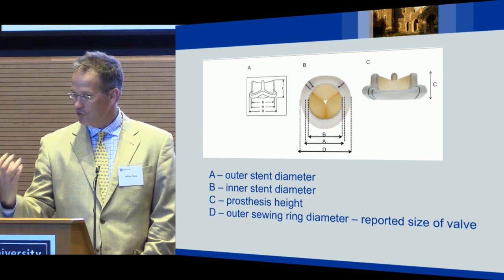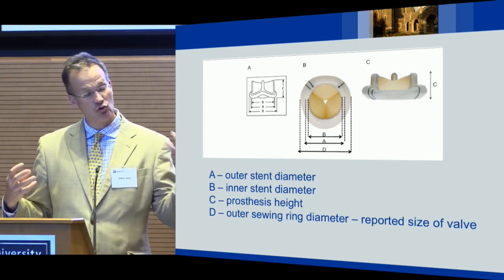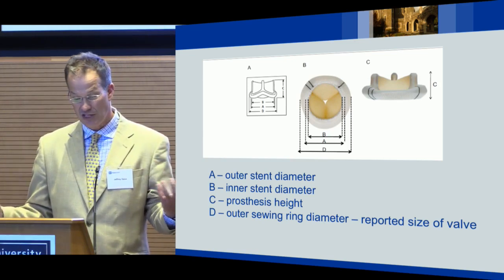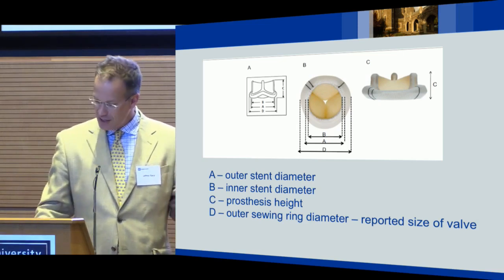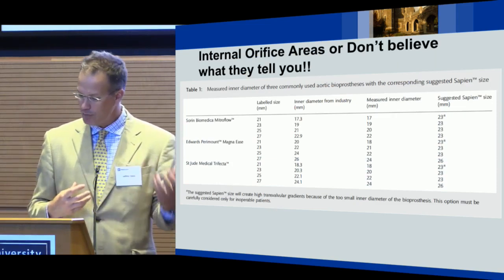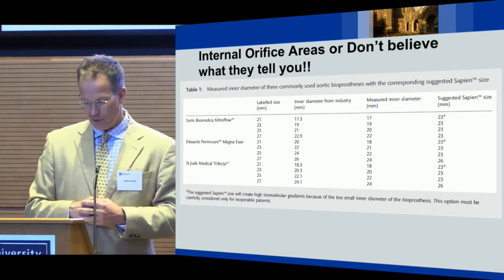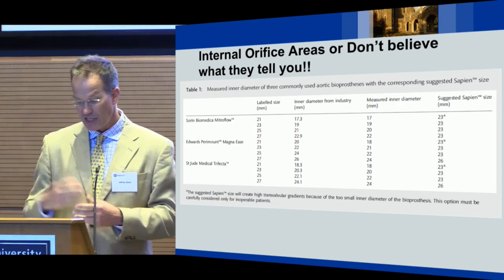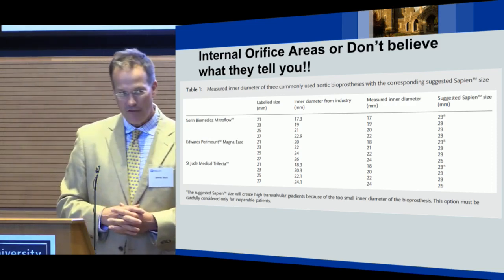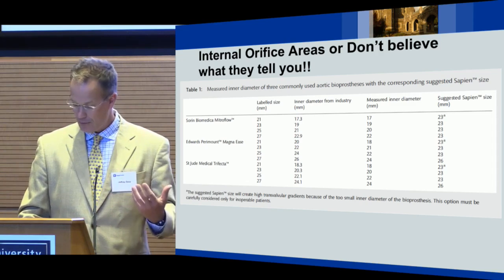And not all surgical valves are created the same. A 23 millimeter porcine valve may have a worse inner diameter than a 23 millimeter pericardial valve. You may get two very different results from those procedures, and you have to know that. Interestingly enough, the manufacturers aren't really interested in you knowing that, because this is a big deal, and what they report may not be what it actually is. You can see here that a Sorin Mitroflow 21 millimeter valve has a reported inner diameter of 17.3. It's really 17. A Magna Ease has an inner diameter of 20, but it's really 18. Those are small valves, and that's going to limit your effectiveness in treating those people. Larger valves, much better results.